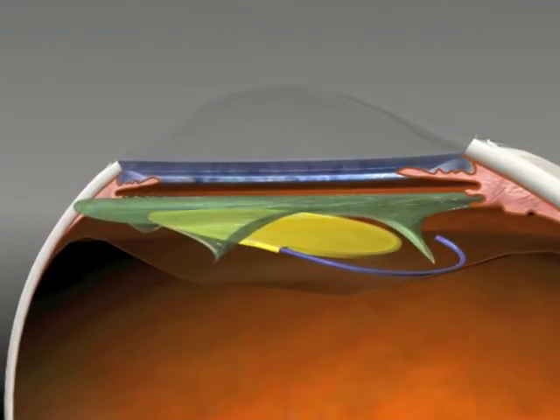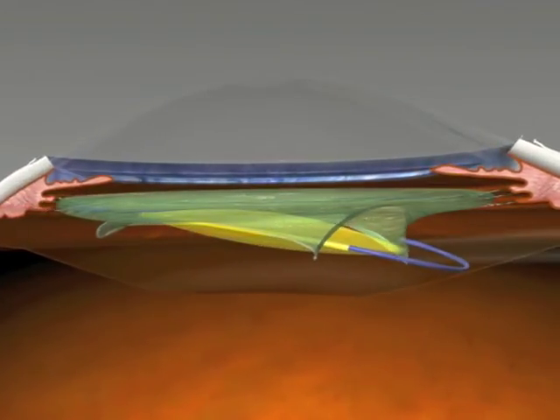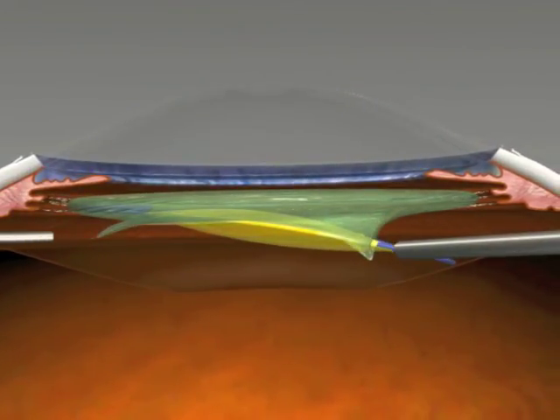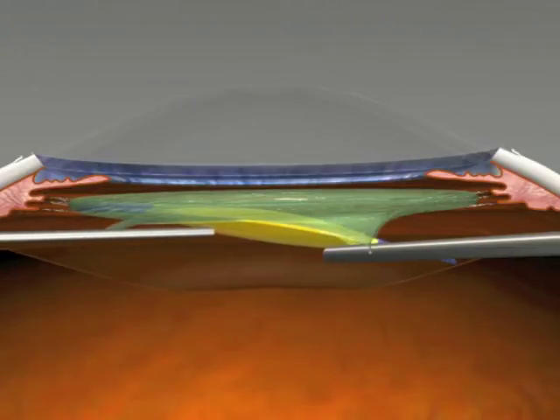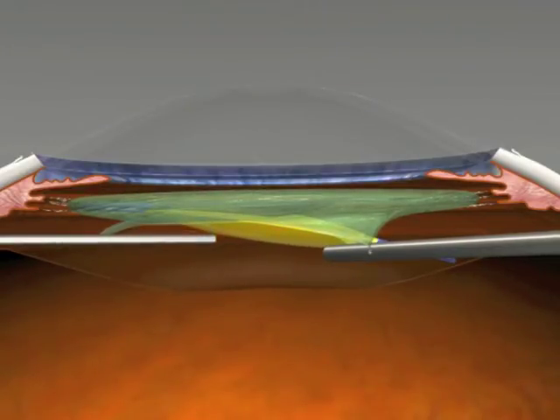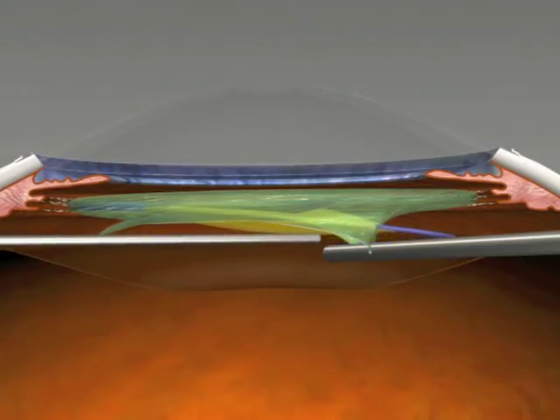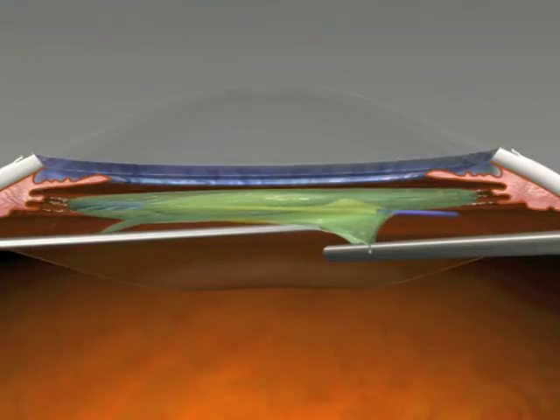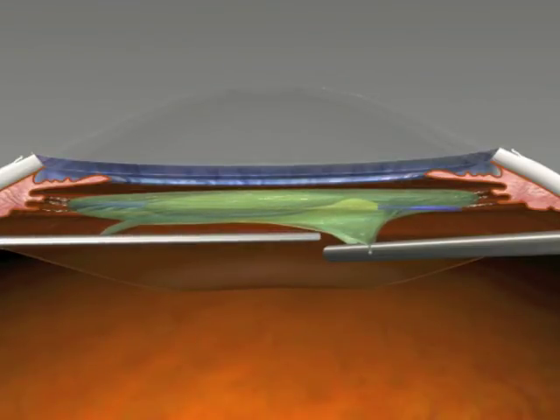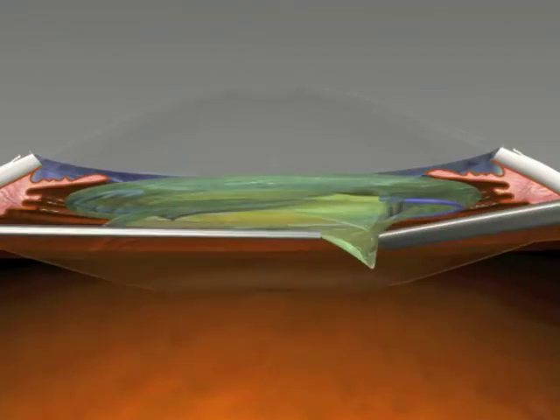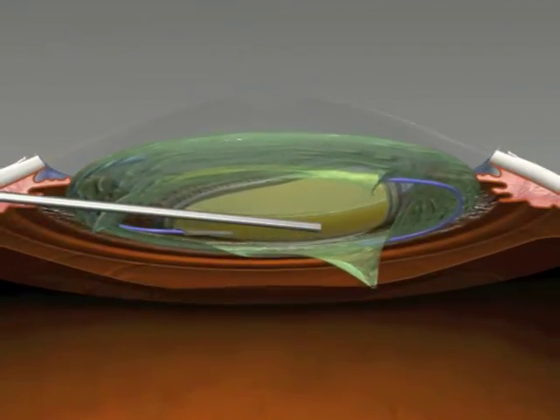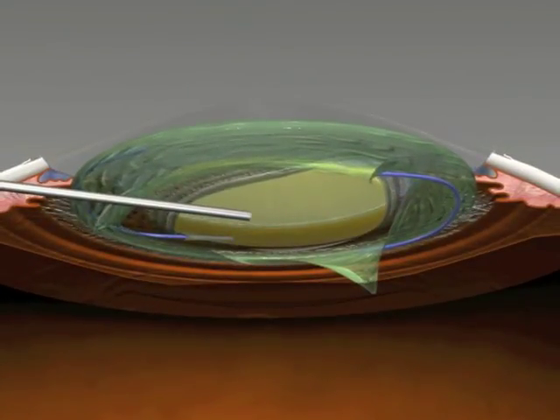Vitreous retinal surgeons have to manage posterior dislocated lenses. If the membrane has an opening appropriate for capture, or can be made appropriate, the optic can be pushed up through for membrane optic capture, rather than to use scleral fixation or anterior chamber lens in these situations.